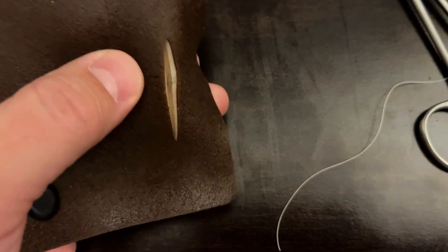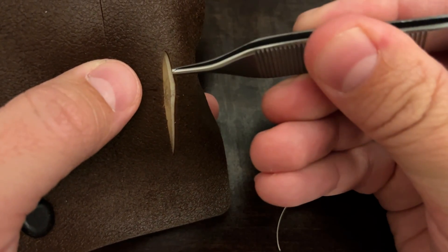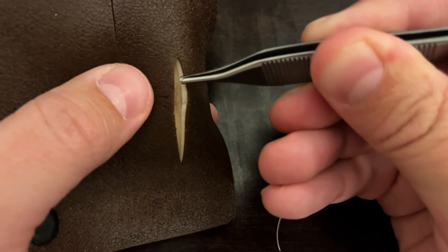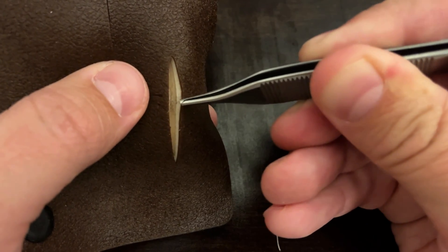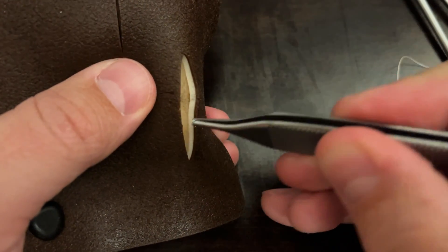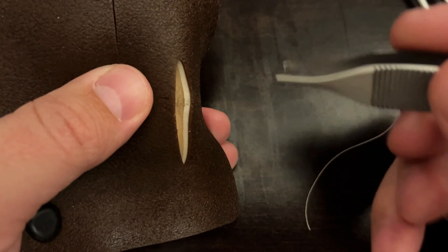Notice we've got a more superficial layer which is our epidermis, and then deep to that is a little thicker dermis. Those two layers make the primary skin layer — epidermis and dermis. And then deep to that, this yellowish tissue is the subcutaneous fat.